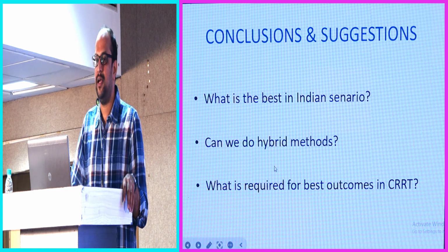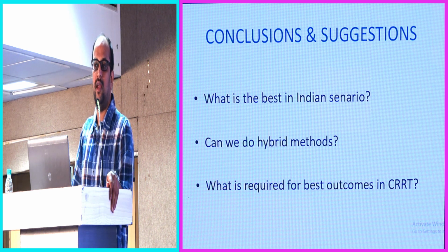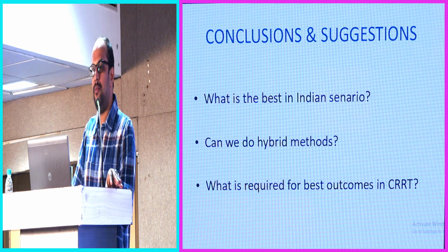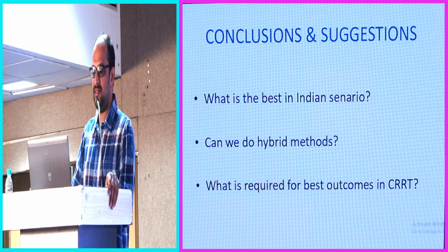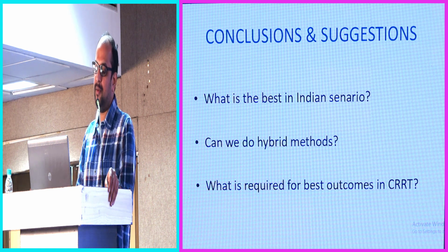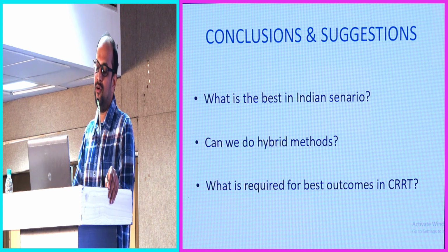And coming to the hybrid methods, sometimes a patient comes to the hospital at 8 o'clock in the evening, and his noradrenaline requirement is around 5 ml. We want to start CRRT, but as my previous teacher said, before taking clearance from all the departments, financial clearance, patient attendant clearance, we may reach around 2 o'clock in the morning.